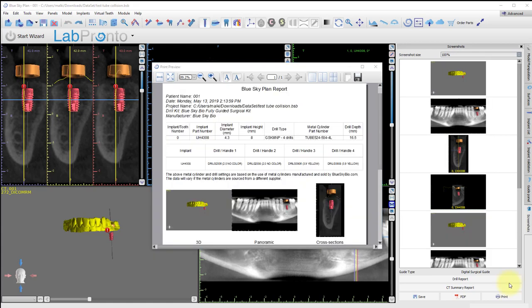Compare this to a screenshot of the drill report before raising the guide tube. We see the original drilling depth was only 16.5 millimeters.